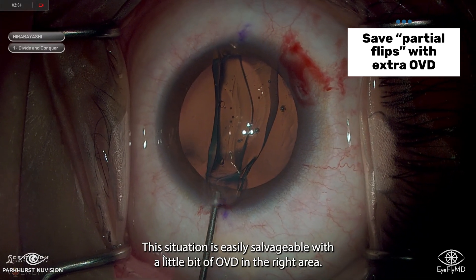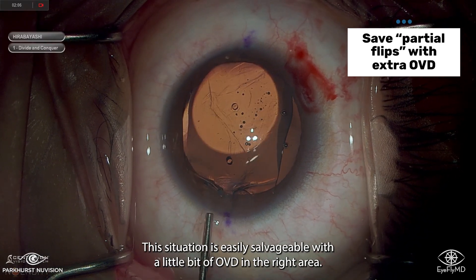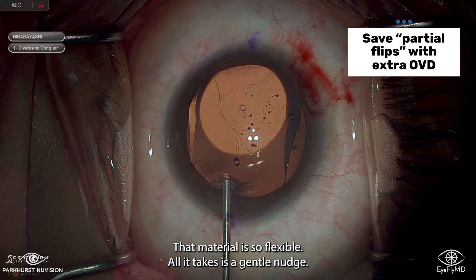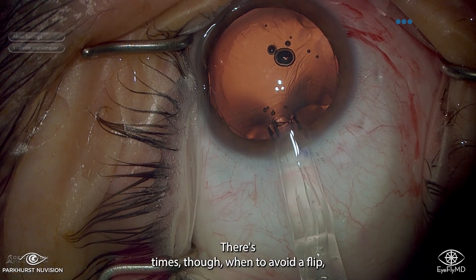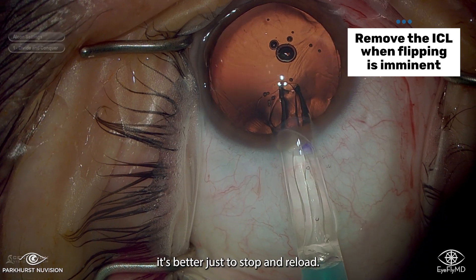This situation is easily salvageable with a little bit of OVD in the right area. That material is so flexible, all it takes is a gentle nudge.